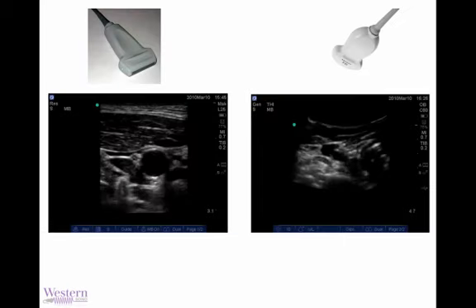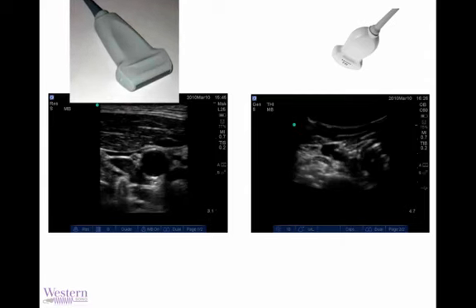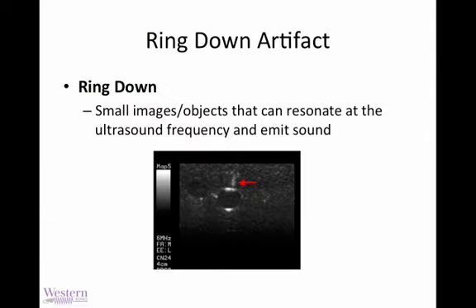By comparison, you can see on the right here the same image, this vascular image here, compared to this one here, obtained with a curved linear probe, though at a similar depth of 4.7 to 3.1 centimeters, the anatomic detail is really all but lost for a near-field structure such as these vessels. So we will always choose the linear array when doing ultrasound-guided vascular access.